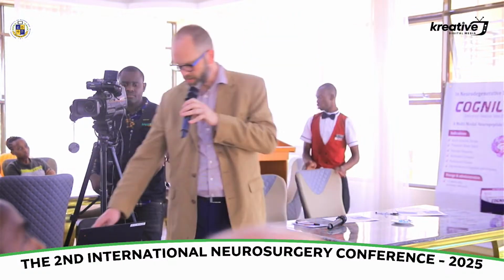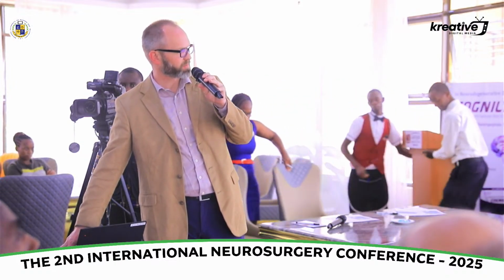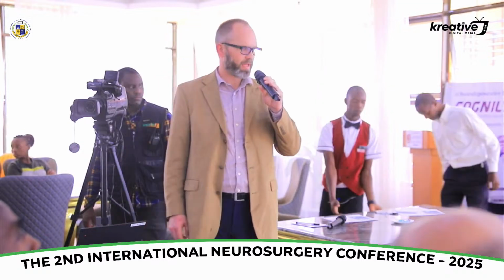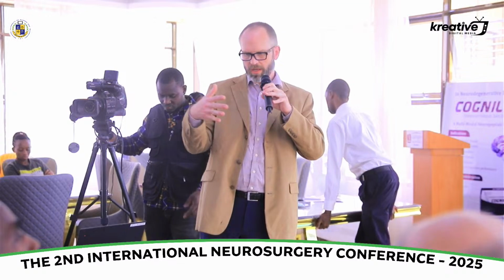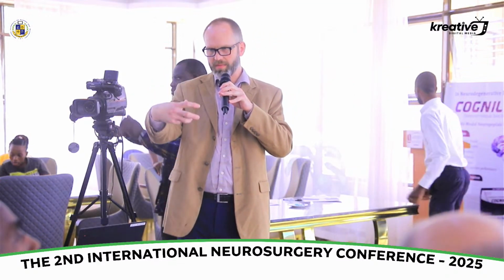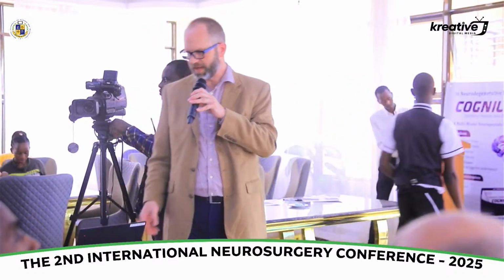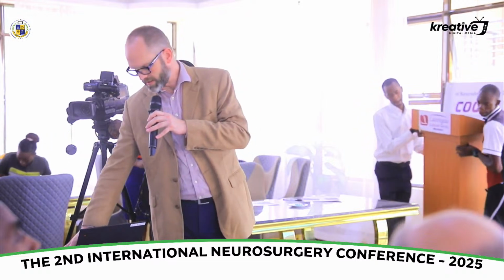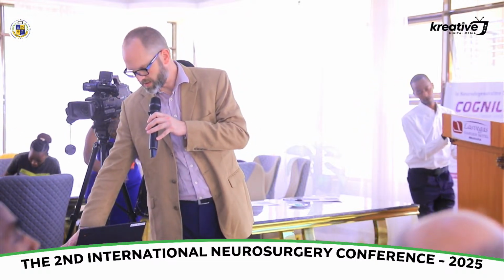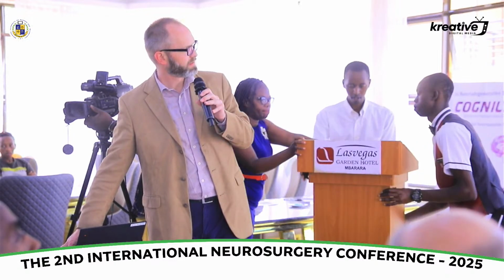It was mounted on a cylindrical chamber, and it resonated at 15 megacycles per second, and then went through water that was in the chamber to essentially a rubber condom that it was on the end, and then they tried to see if they could send these through tissues and whether they could tell if there was tumor inside brains or not. And this is a diagram of that.